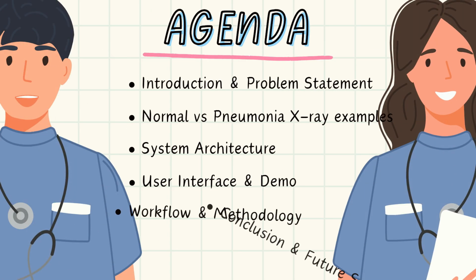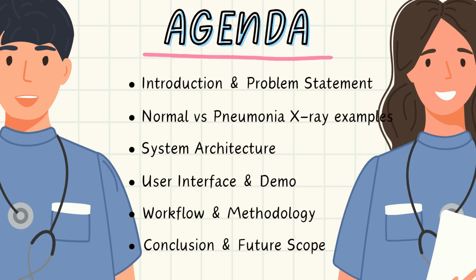Here is what we will cover today. First, the problem. Why pneumonia detection is harder than it looks. Then I will show you what normal versus pneumonia x-rays actually look like. Next, I will walk you through the system architecture, the technologies and design choices that power its solution.